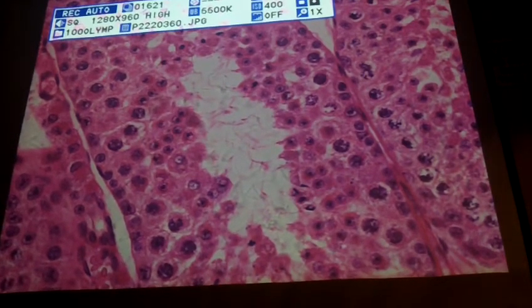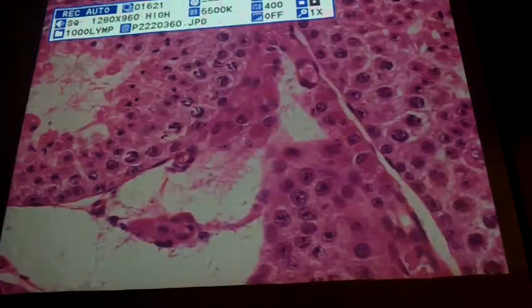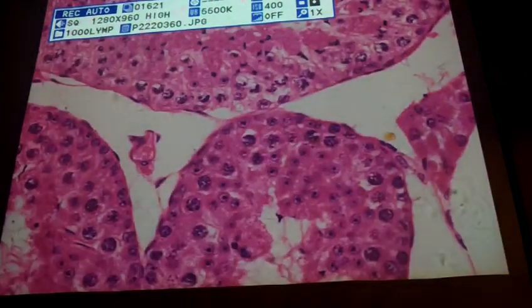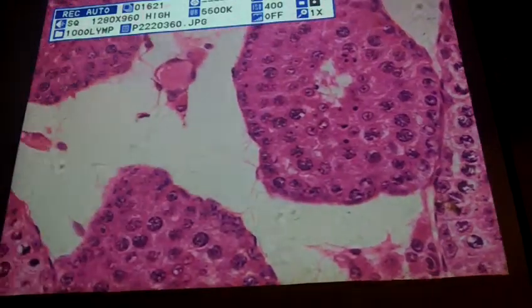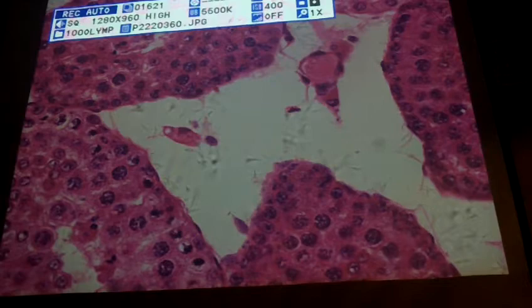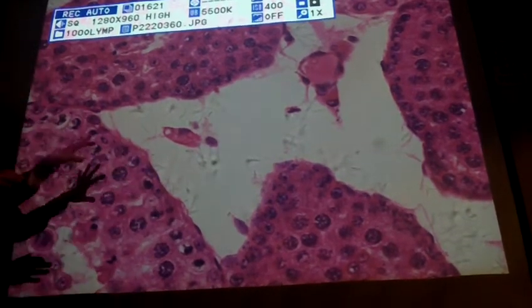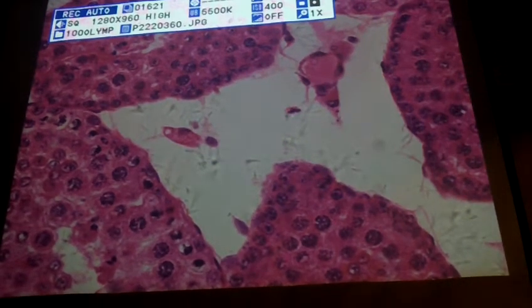Again, really spend a little bit of time between looking at this versus the epididymis so that you can tell the difference between a really kind of ratty look to the inner layer of cells as opposed to tails hanging off of the edge of this area lining the lumen.